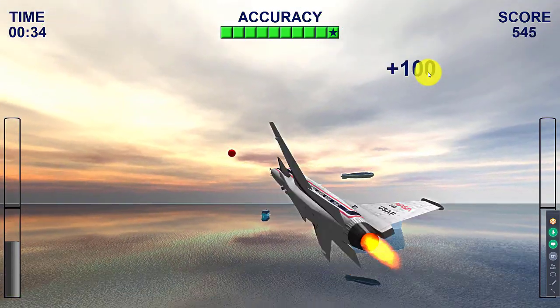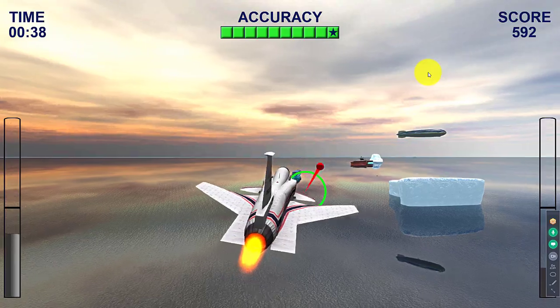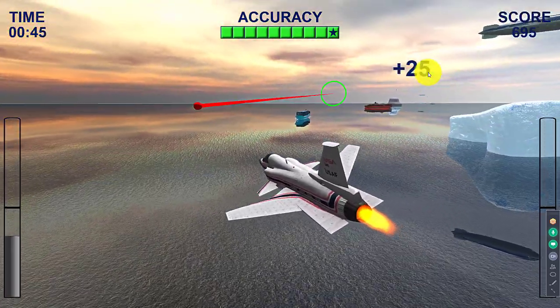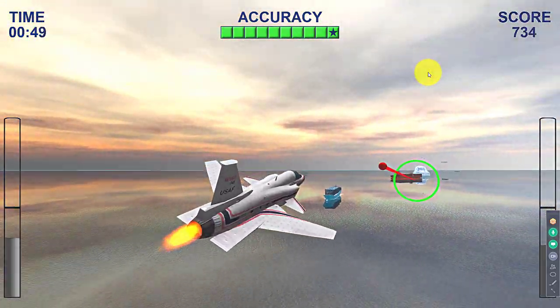And you can actually set it, now this was perfect, you can actually set it to a way that initially you only have so many flying objects, and then when people train with it, they get more flying objects available. And yeah, I think this demoed that quite nicely.